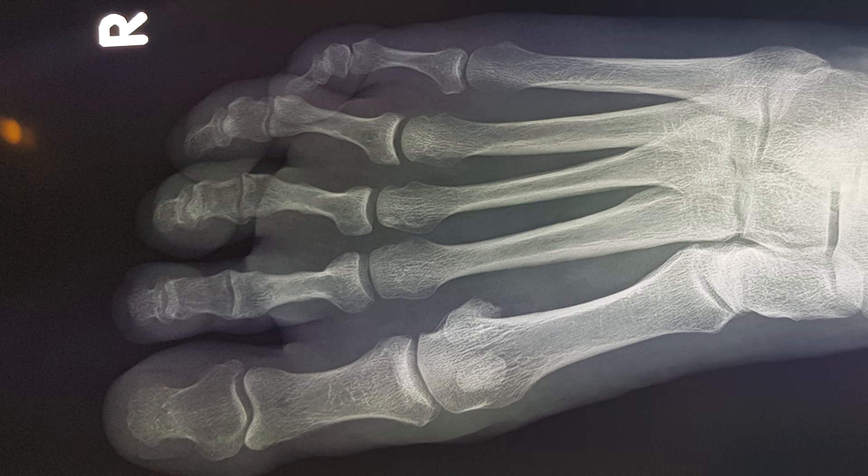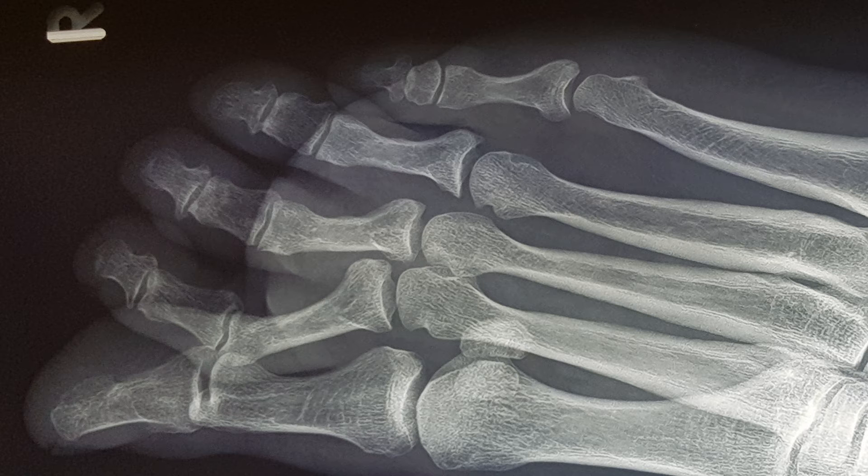We can see on X-ray that all is fine at the metatarsophalangeal joint level — there's no subluxation or dislocation. The PIP joint deformity is actually pretty hard to see on the DP view, but it's definitely obvious on the medial oblique view.